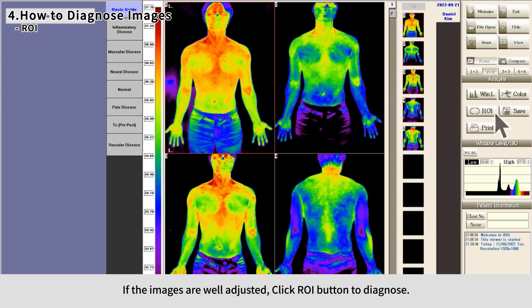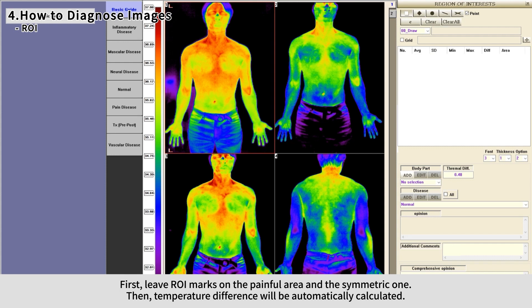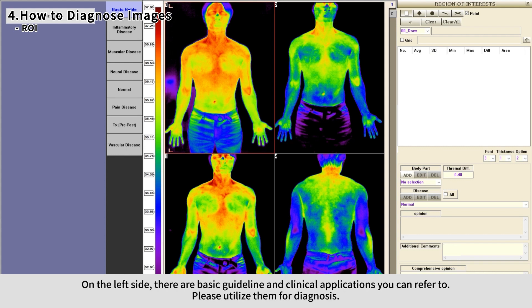Once images are well adjusted, click the ROI button to diagnose. If the temperature difference between the painful area and the symmetric area is higher than 0.5 degrees, potential issues are usually suspected. Leave ROI marks on the painful area and the symmetric one — the temperature difference will be automatically calculated. On the left side, basic guidelines and clinical applications are available for reference during diagnosis.